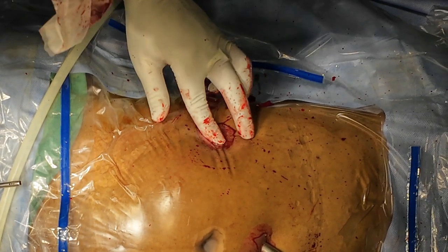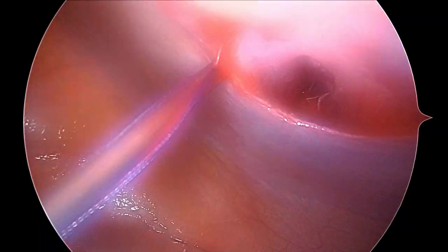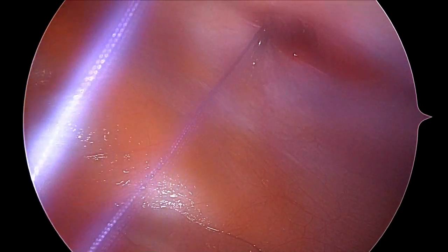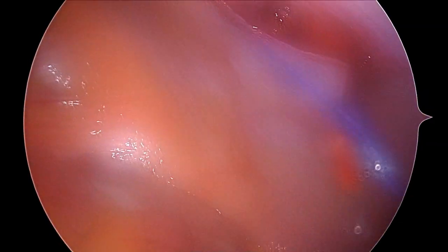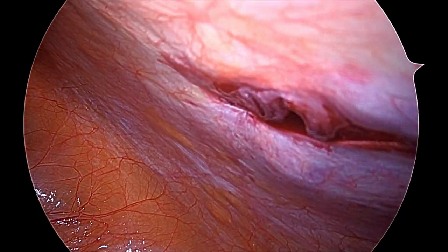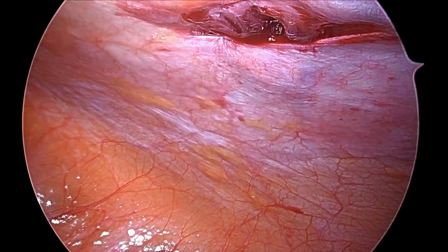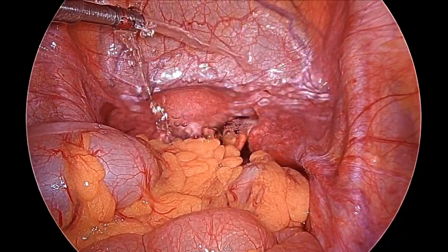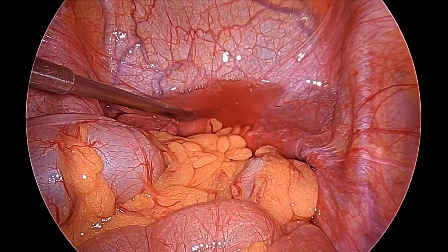Port closure is essential in this case because whenever tissue extraction is performed the wound is dilated, and without port closure there is a risk of incisional hernia. We use a cobbler's needle to perform port closure, and the entire wound is closed with number one Vicryl. You should not go too lateral — stay on the margin and do not close too tightly, as that may cause pain and tissue necrosis from ischemia. Ensure gas is not leaking — that is sufficient.